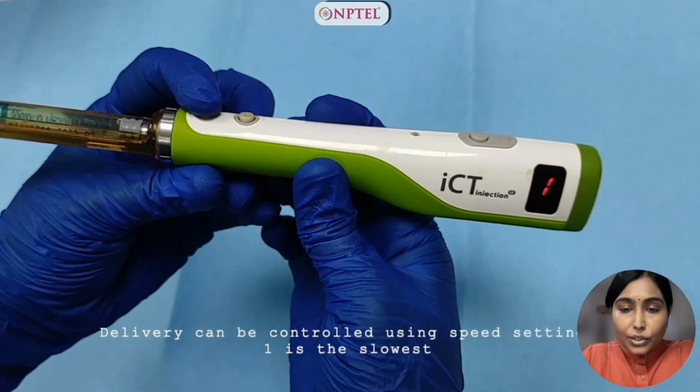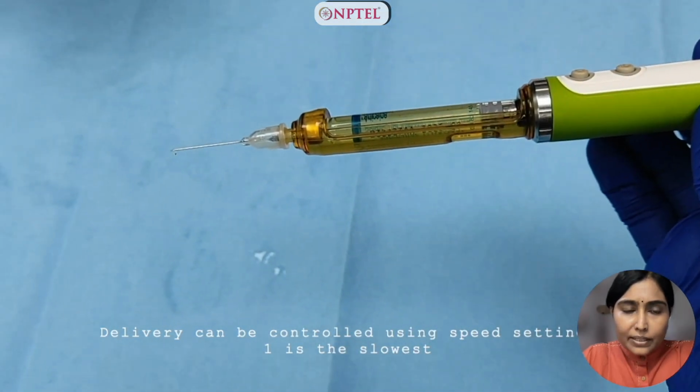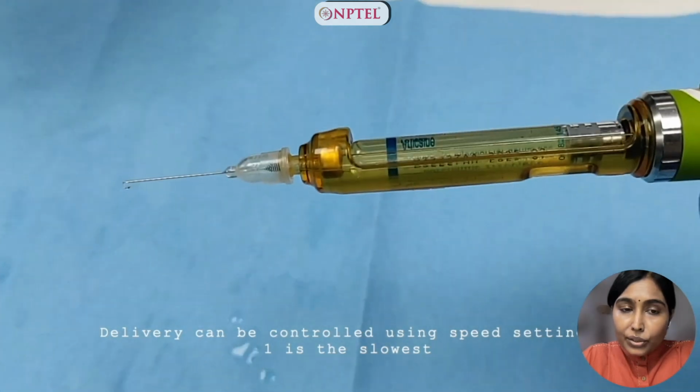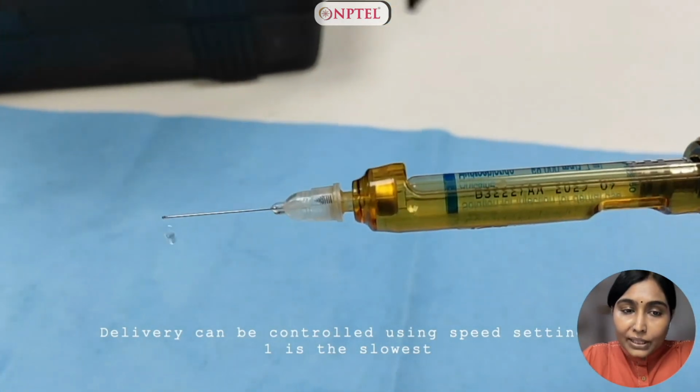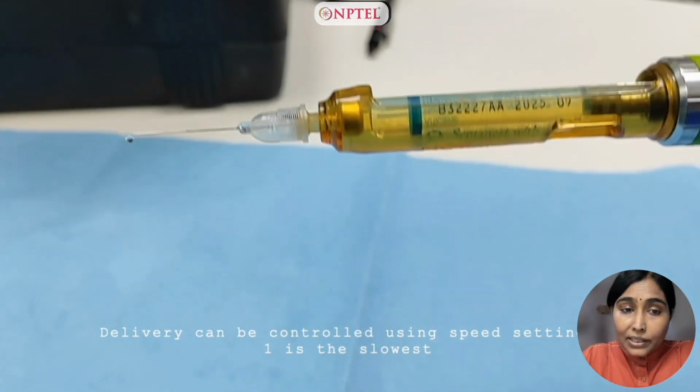Now delivery is controlled by using the speed settings. The first is the slowest speed. You can see the trickling of local anesthetic solution through the bevel of the needle. The speed is really slow.